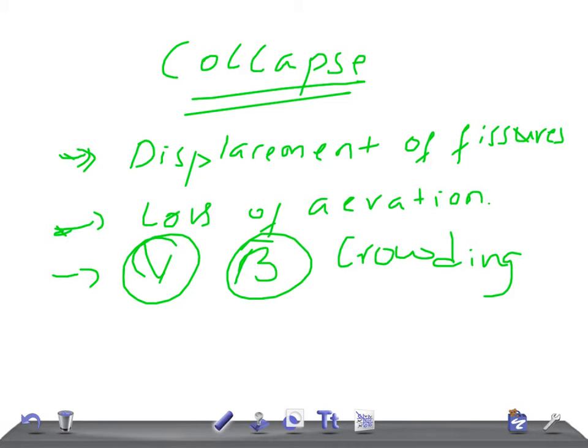These are the direct signs: displacement of the fissure (most reliable), loss of aeration, and vascular and bronchial crowding.